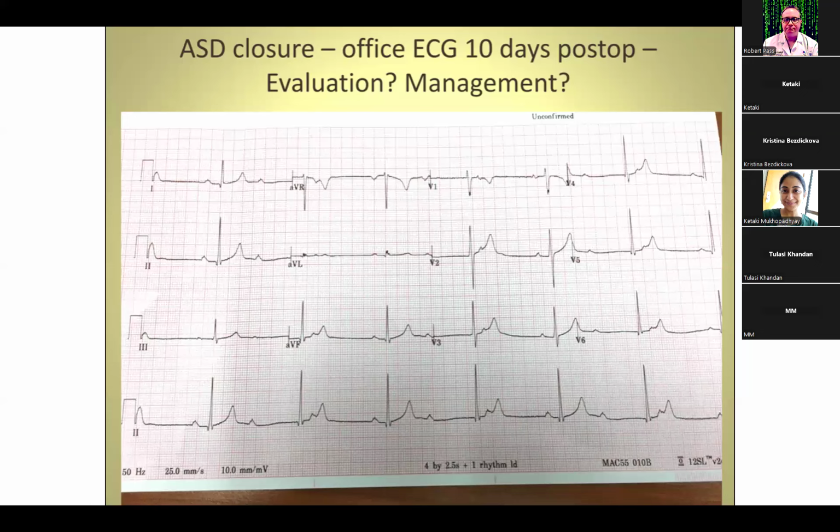Sorry, I keep hearing myself, so I was wondering if something's unmuted. One second. Sorry. And then I see the P wave, which doesn't have a P wave, and a dropped QRS complex, and then I see a QRS complex which looks similar to the other QRS complexes. And then something which looks like a P wave on top of a T wave, and then no QRS complex following that P wave, but then another P wave later on. So I think P waves are.